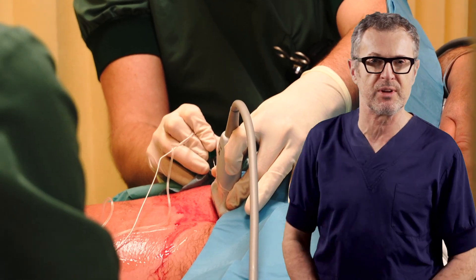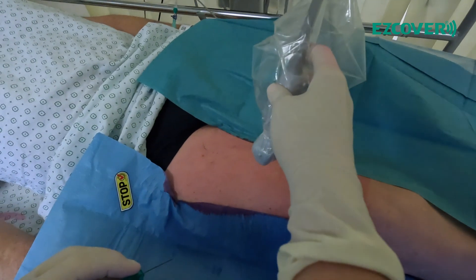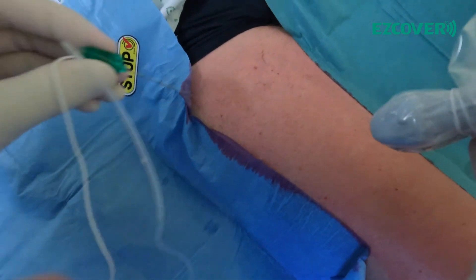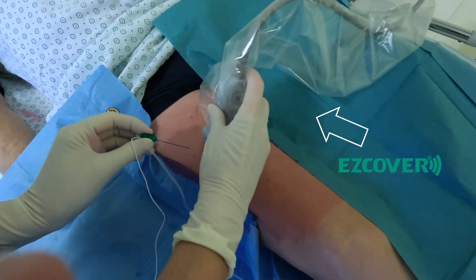Let's now see the use of local anesthetic in sterile gel to accomplish the femoral triangle block for analgesia after total knee replacement. We're going to do a spray right there with the local anesthetic. There we go — now you're ready. Image.